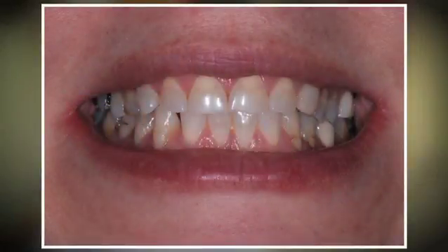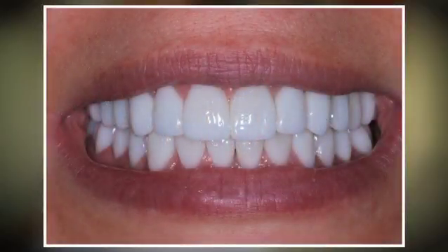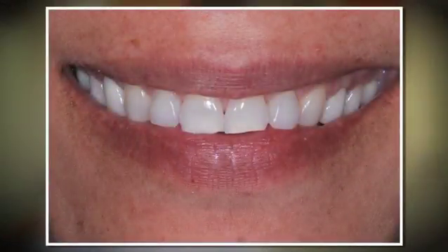Once the teeth are prepared and the patient is in provisional restorations, models of those provisional restorations are sent to our aesthetic laboratory, and that's where the restorations, the fine porcelain restorations, are fabricated.